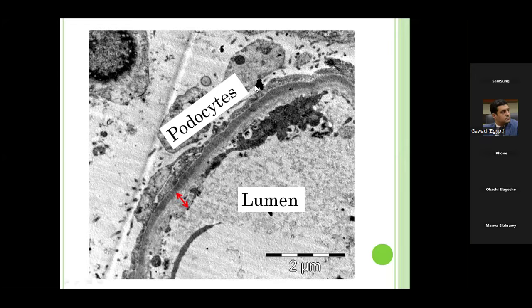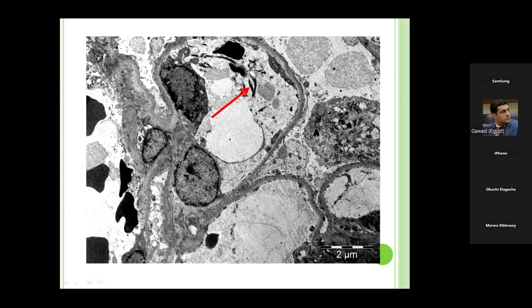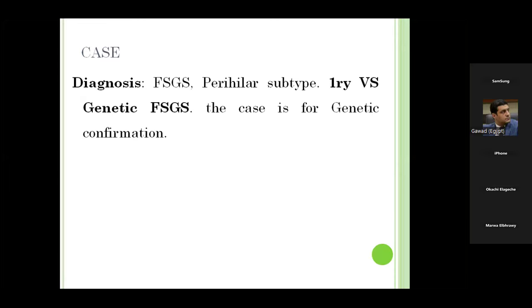These could be found in cases of formed thrombi, but here the endothelial injuries probably occurred secondary to hypertension in this case of nephrotic syndrome. It did not end up with a formed thrombus, but it was an incidental finding with these fragments of RBCs. Again, these tactoids. And this was not mentioned in the diagnosis.